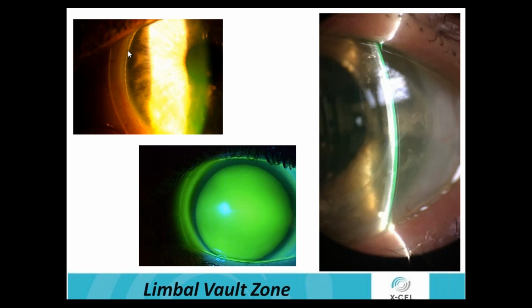All right, well, she was supposed to take the lens off. We then put the same exact lens on her, or she applied the same exact lens, and the only difference was we increased our limbal zone. So we increased just this zone on this patient. Well, she put the lens on and she was terribly uncomfortable. We asked if we could get her under the slit lamp and she obliged. And we took this picture.